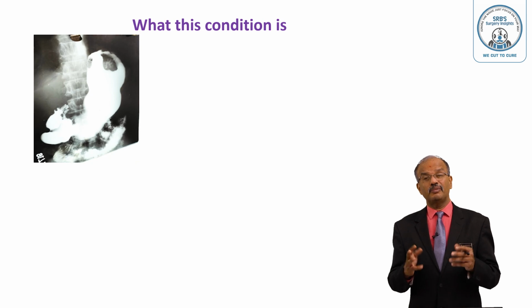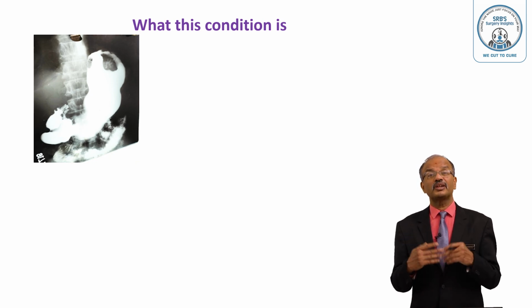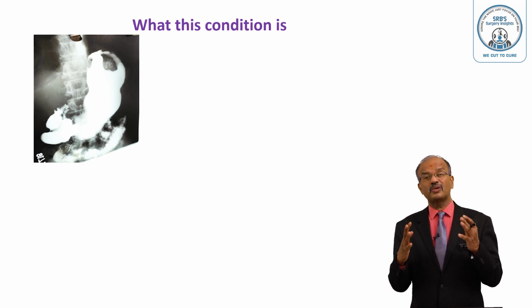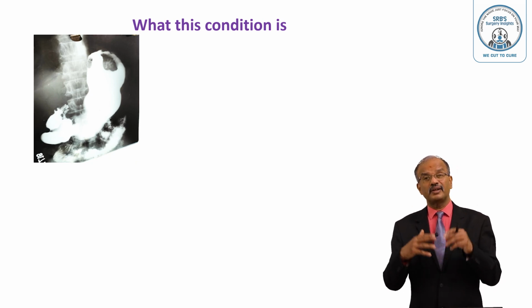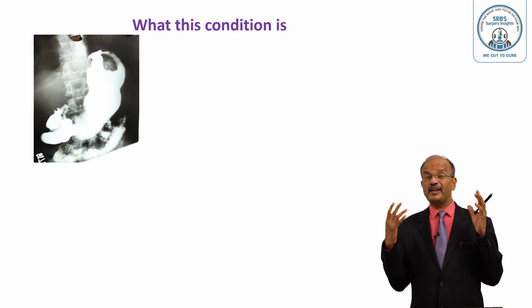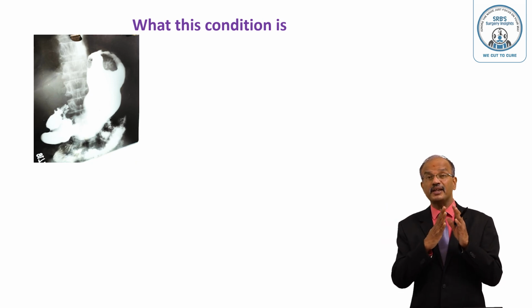It's inert. So barium sulfate solution is given to the patient to drink, around 500 ml. Currently microcrystalline barium sulfate solution is good. It's called microbar solution. Once the patient drinks that, usually under fluoroscopic control, it is visualized in different areas and films are taken. Many films are needed to study properly: fundus, body, antrum, pylorus, then duodenum and jejunum and other areas. Eventually late films will also be taken. That is exactly the barium meal study.